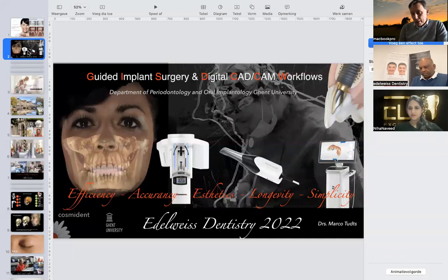The only thing you need in this face scanner is that it can recognize some points so you can match the CBCT data to the face scan. But this is technology, yeah. Yes, doctor. Actually, a follow-up question: can the intraoral scanners be used for face scanning as well? No, the intraoral scanners are not used for face scanning. It's a separate tool which we use for that.